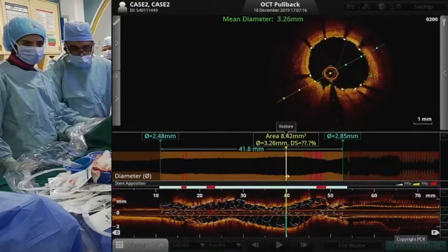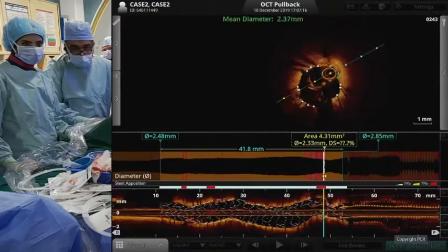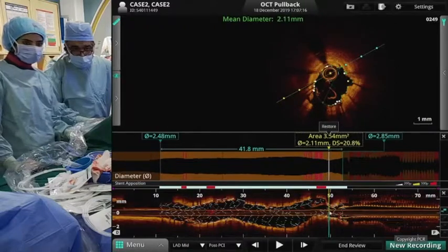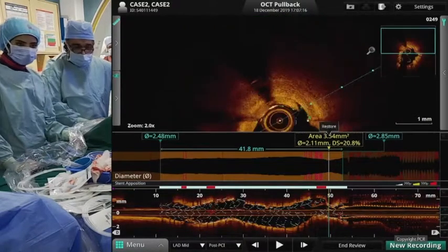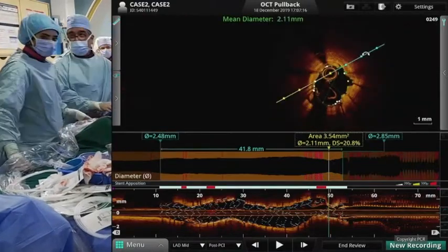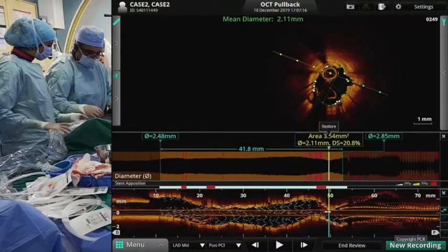And then we go more, it's around 8 and 7 in the proximal segment. So I'm very much pleased. But the only thing I don't have in this run is the proximal edge, because the guideliner is just within the stent. It is a long segment. So I'm going to do one last shot in here, and then we should be done soon.